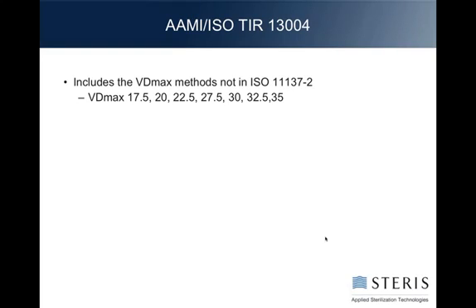Okay. The 13004, this is so that you have it on a separate slide so you know which of the VD-Max methods are in 13004 versus in 11137.